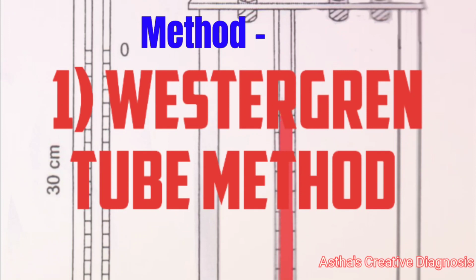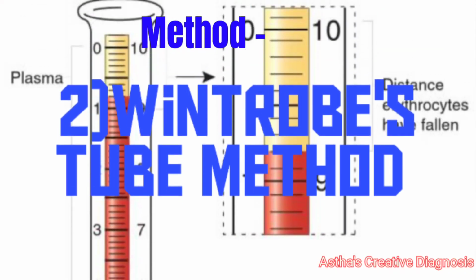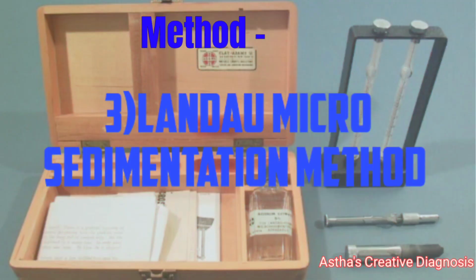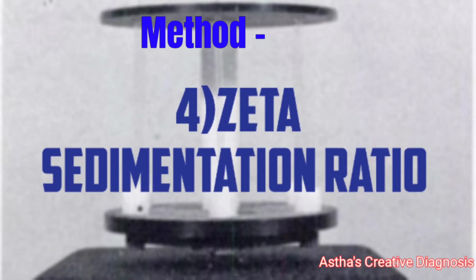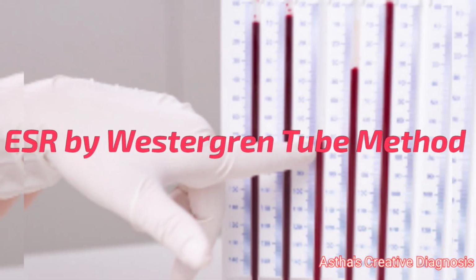Method: number 1, Westergren tube method. Number 2, Wintrobe's tube method. Number 3, Landau micro-sedimentation method. Number 4, zeta sedimentation ratio. ESR by Westergren tube method.